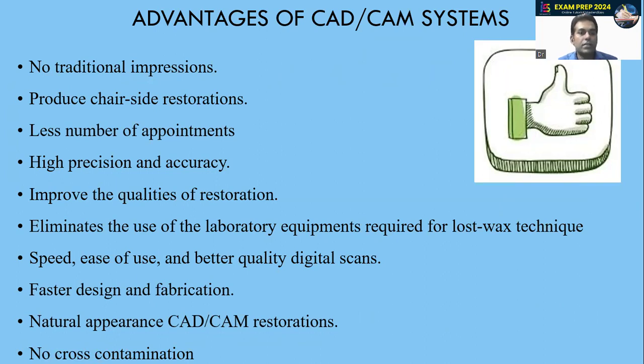Then the next advantage is it produces chair side restorations. Fewer appointments are needed, with high precision and accuracy. It improves the quality of restoration. It eliminates the use of laboratory equipment required for lost wax technique during the casting procedures. Speed, ease of use, and better quality of digital scans, faster design and fabrication. Apart from that, there is natural appearance of CAD CAM restorations. And again, one more important benefit is it prevents cross-contamination.